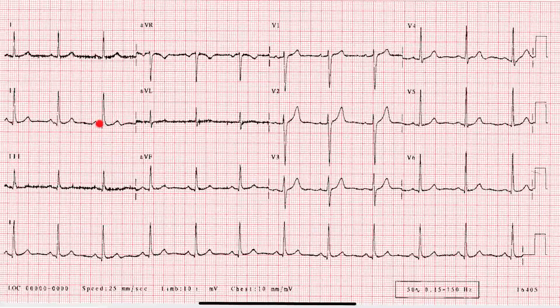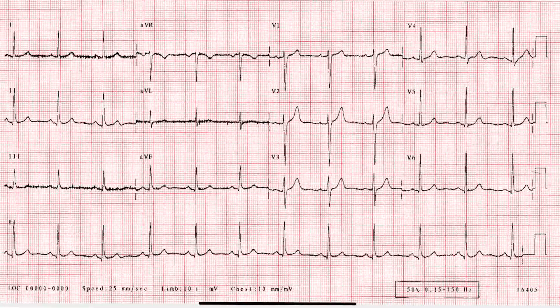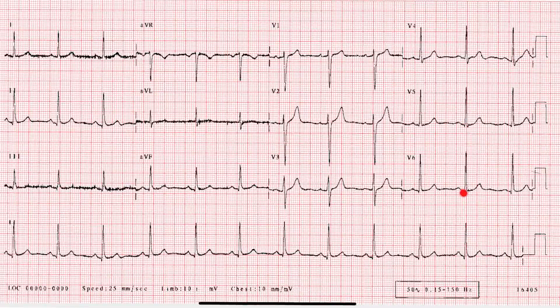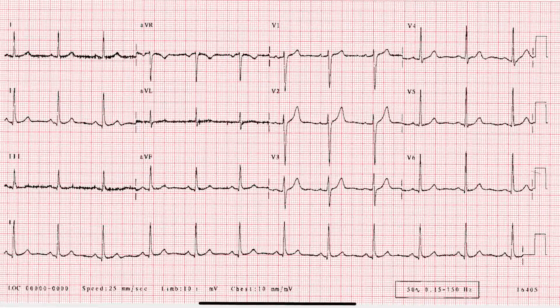Looking at multiple leads, the PR segment appears isoelectric. Don't be fooled by the downslope of the P-wave and think it's depressed — the PR segment is isoelectric. The PR interval is within normal limits. The PR segment and PR interval are constant — not shortened or prolonged within the same lead. Moving to the QRS complex, in V5 and V6 there is a small Q-wave — a septal Q-wave. Based on the axis being upright in lead 1, AVF, and lead 2, the axis is likely near 90 degrees, so we also expect septal Q-waves in inferior leads.